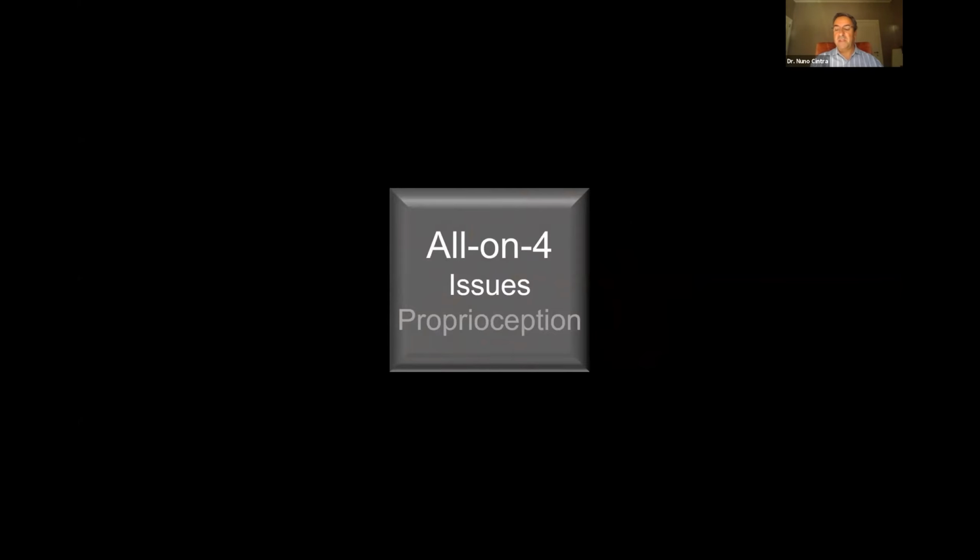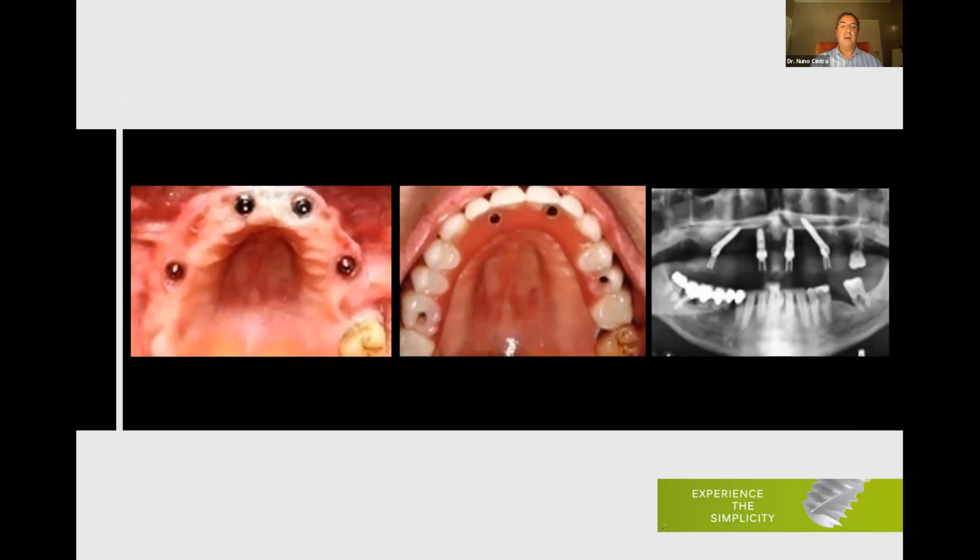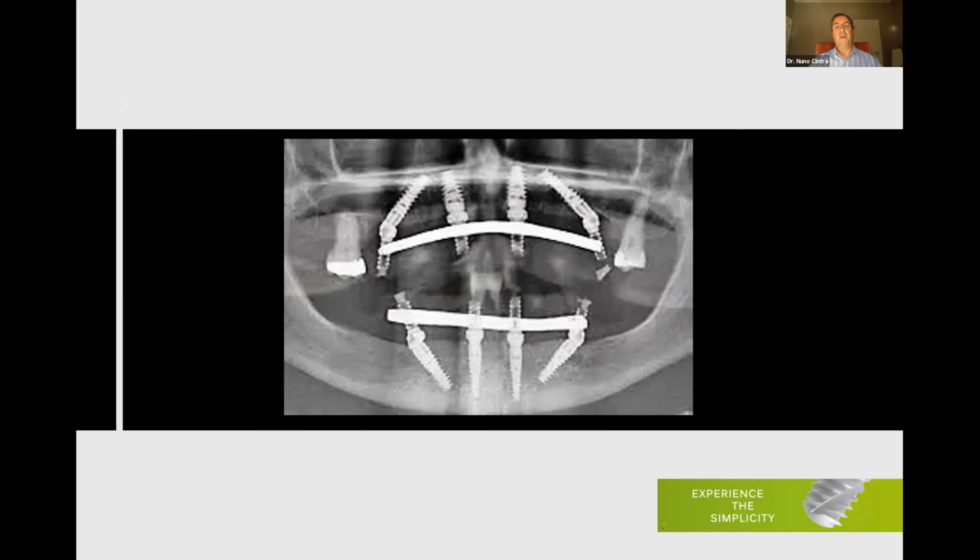Now, proprioception, as you saw in the previous slide, sometimes we leave some teeth behind, mainly some molars, the 7s or even the 8s, if they are okay. And that is due to 2 things. First, it can help us with the vertical dimension. As you can see there, if we have one up and one lower, that will help us with the vertical dimension, but for sure, it will help the patient with the proprioception, because otherwise he loses all the guidance. Keeping 1 or 2 teeth will help the patient with the proprioception of knowing where to close, how much they can bite, all those issues that proprioception gives us. And we can keep these teeth during the healing period, during the provisional period, or we can keep them also after the final rehabilitation.